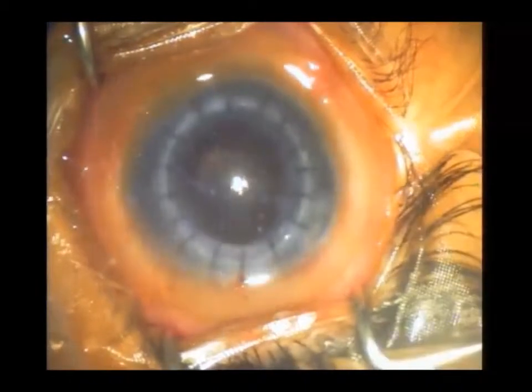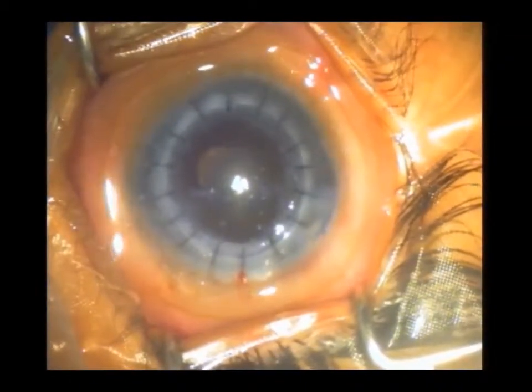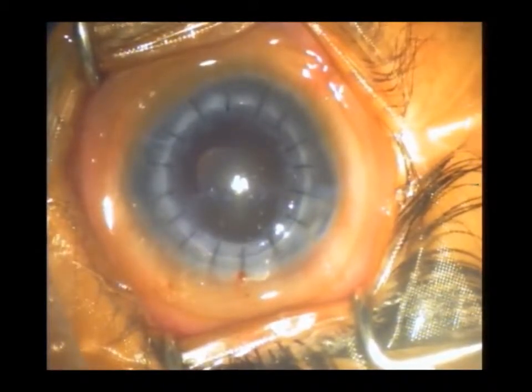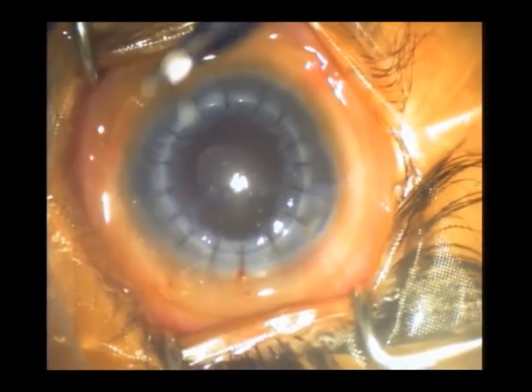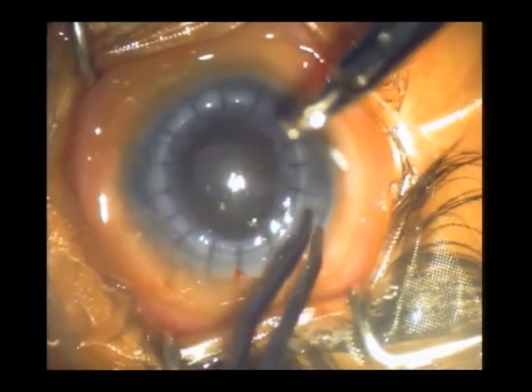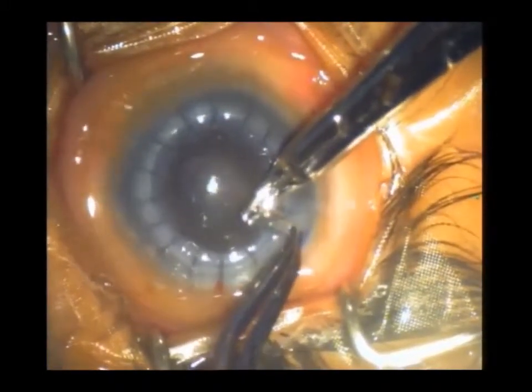The side port is then hydrated. The side port should also be sutured in the pediatric age group to prevent any postoperative leakage.